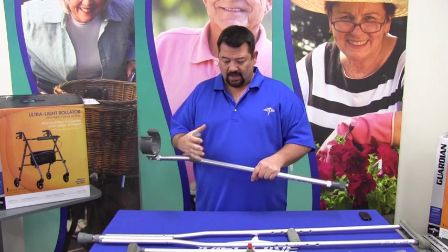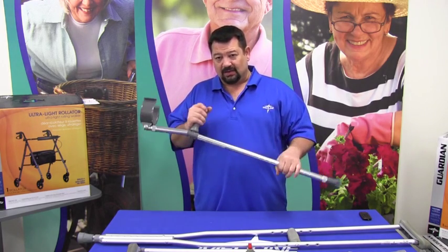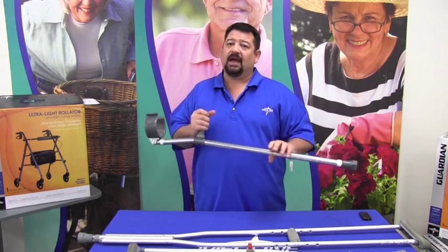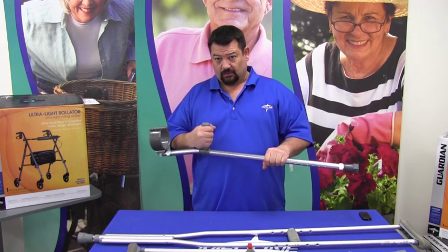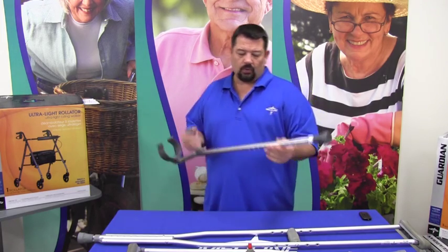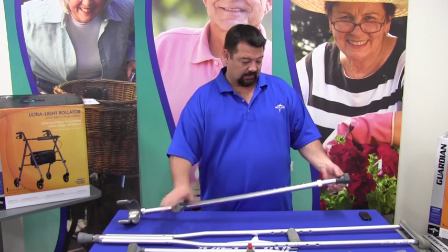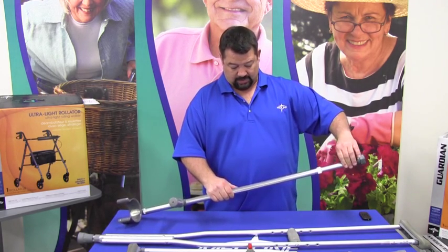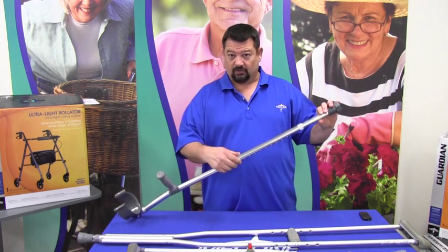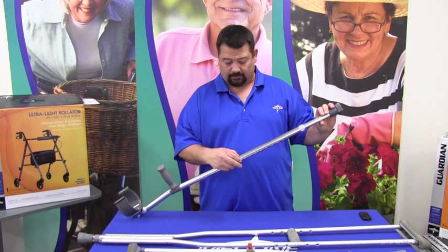Ground to the crease of the wrist. That gives you a good starting point, but there may be a need to adjust depending on the patient's comfort and familiarity with using the forearm crutch. So, basic adjustment: you've got a collar, you've got a leg that telescopes in and out, and you have a series of push buttons. On a forearm crutch, the push buttons are on both sides.